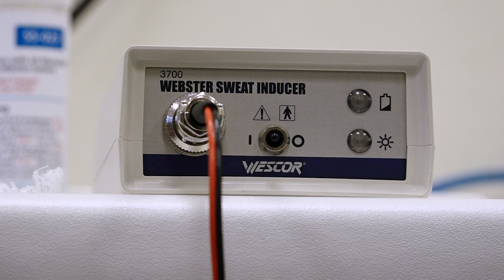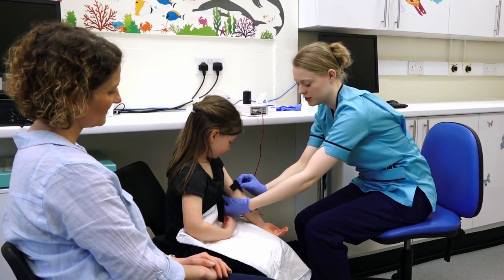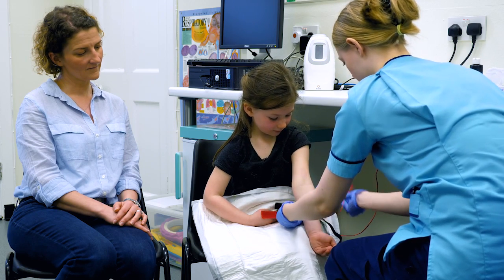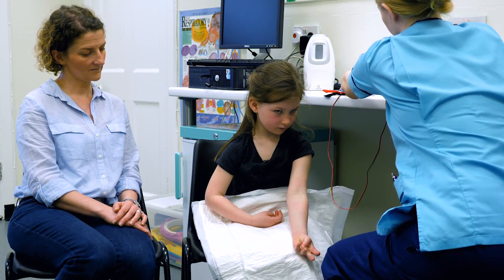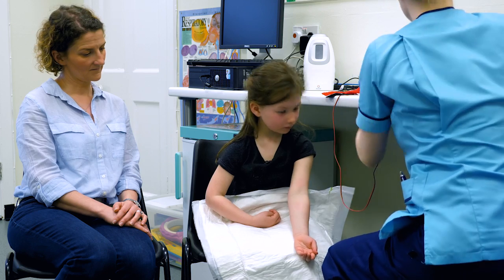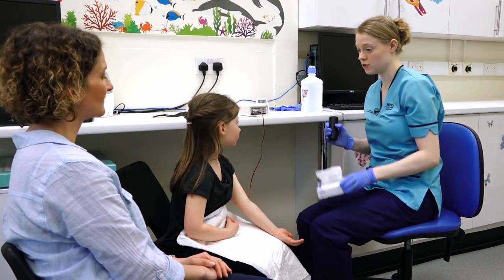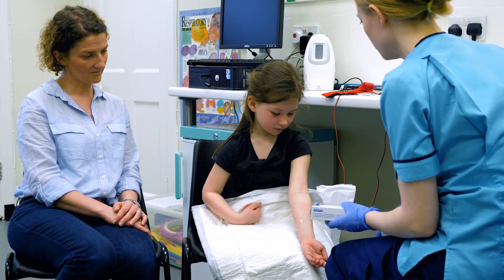That's the machine finished now, and I'm just going to pop this one off — I need you not to touch your arm. See, it's left a wee red mark. And we'll just pop these up here out of the way. Now we've got to wash your arm five times and dry it five times.